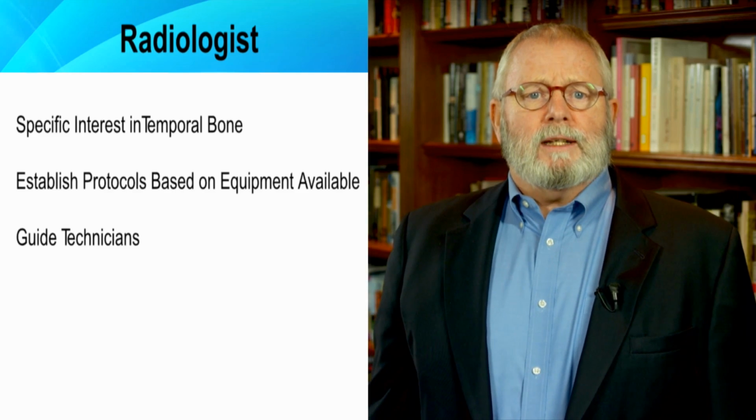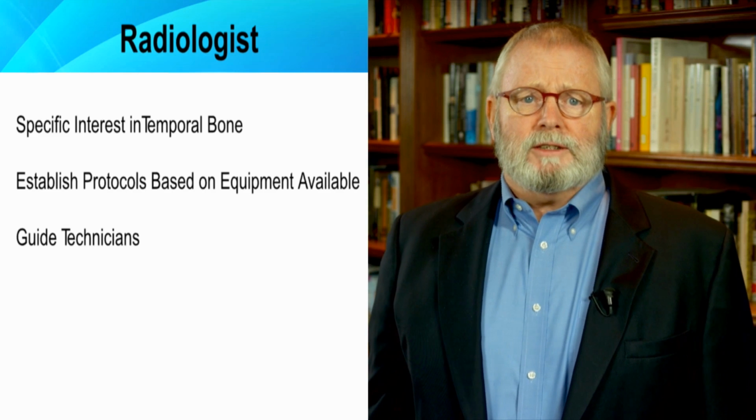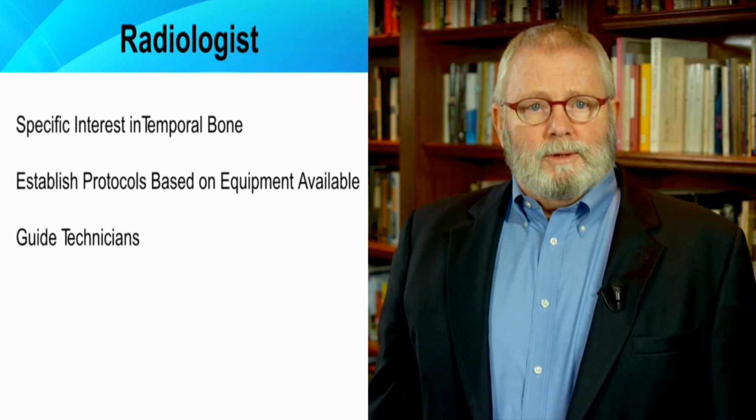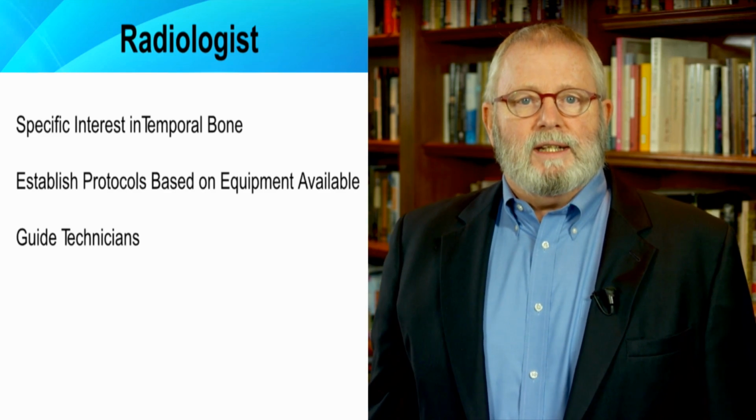Minimal obstruction of the cochlear duct, subtle modiolar defects, and changes in the cochlear aperture, for example, will not be overlooked. An experienced radiologist will guide technicians to make sure the appropriate sequences are obtained. This is important because the imaging sequences needed to evaluate cochlear implant candidates are different from those generally utilized in brain imaging.